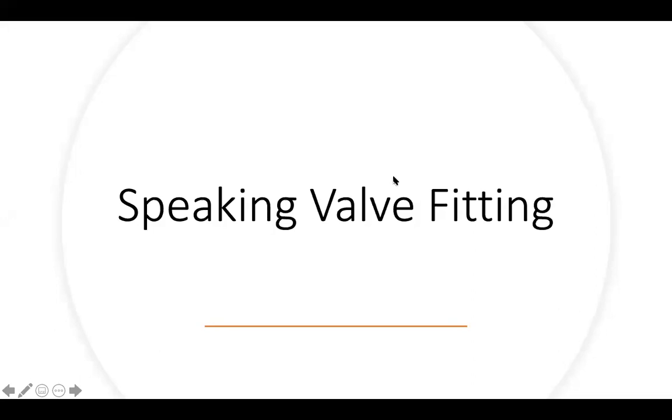Someone asked again, what's the difference between fenestrated and non-fenestrated? I did show two pictures. Fenestrated means that the trach has a hole in the back, and non-fenestrated means that the trach has no hole in the back. And someone asked, what's our role in decannulation? I will start talking about that right now.